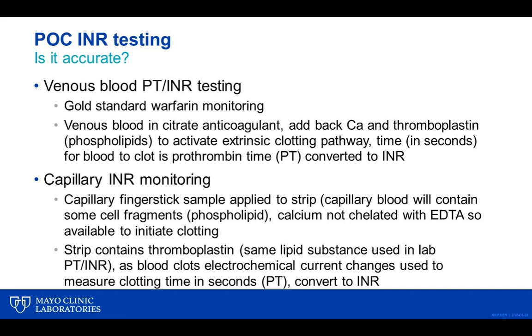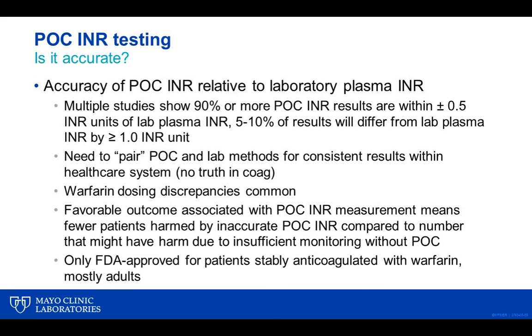We have to use an electrochemical current change to assess the blood clotting. When I think about it, it's sort of amazing this works and correlates as well as it does. It's a little bit of a miracle that several companies have made capillary INR match the lab INR so well. So how accurate is capillary INR, given that you're trying to reproduce an optical clotting reaction in the laboratory with an electrochemical strip on the finger stick method?